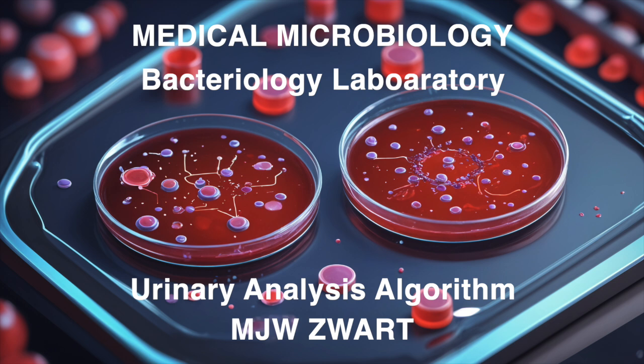Even if the Q-score suggests contamination, they still emphasize the importance of performing a Gram stain. Ah, the good old Gram stain. A classic for a reason. But how does the Gram stain fit into this algorithm? The Gram stain gives you a visual snapshot of the bacteria present. You can see their shape, their arrangement, and most importantly, whether they're Gram positive or Gram negative. This information can help guide your next steps, especially when choosing which agar plates to use for culture.